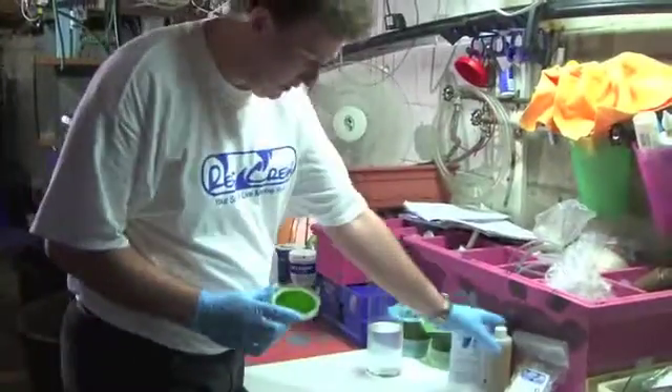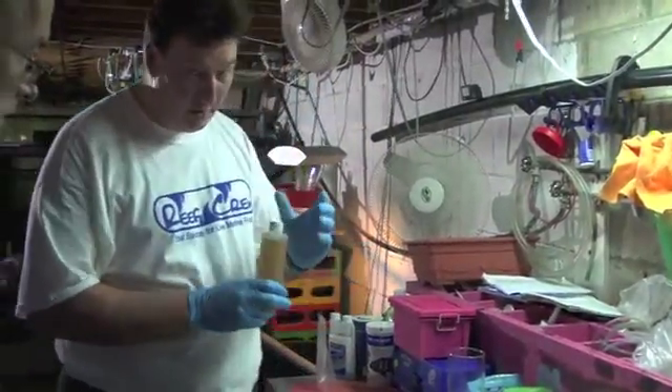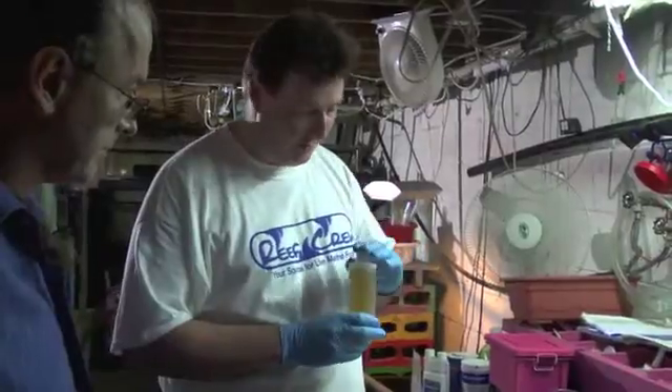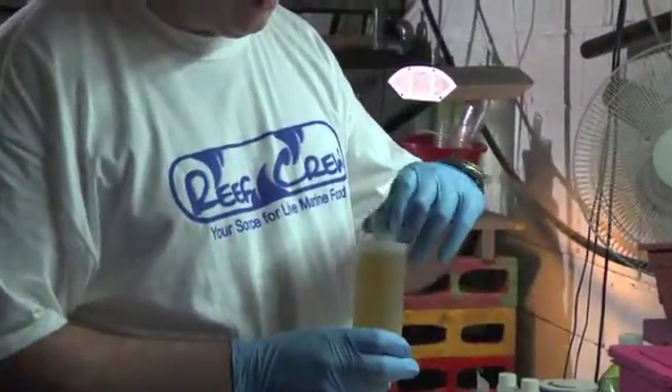So basically we're just going to open up the disc. Although there's already fertilizer on the actual disc, we're going to add a little bit of fertilizer culture medium. This is an F2 medium that we use to grow the algae.